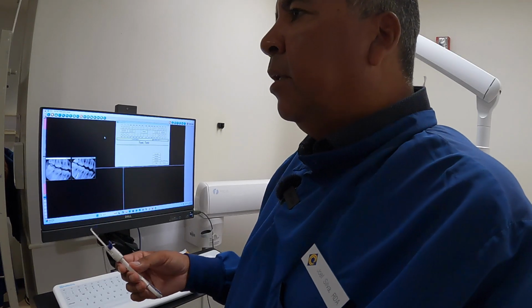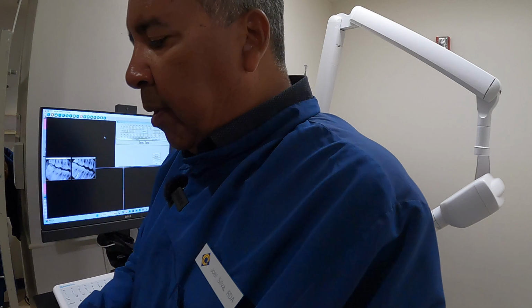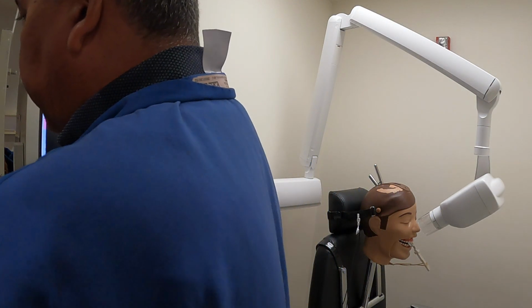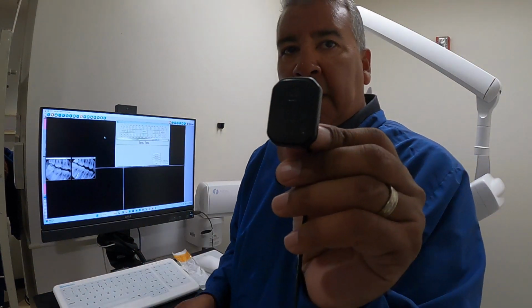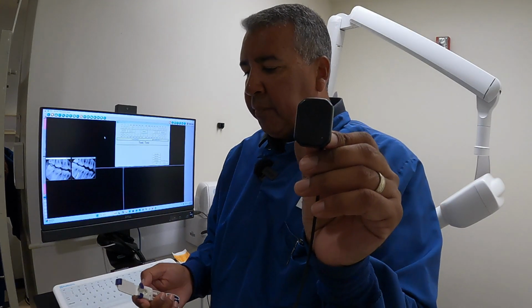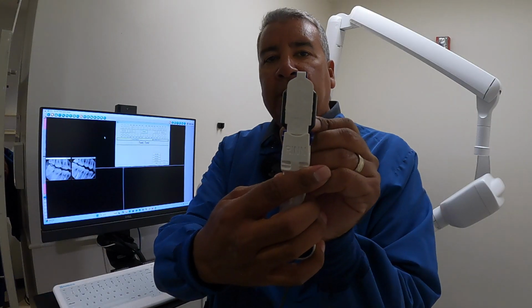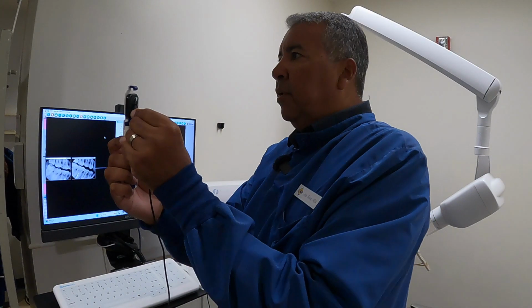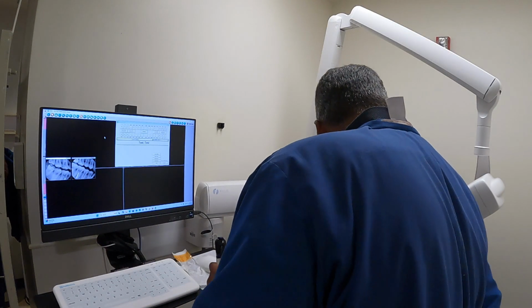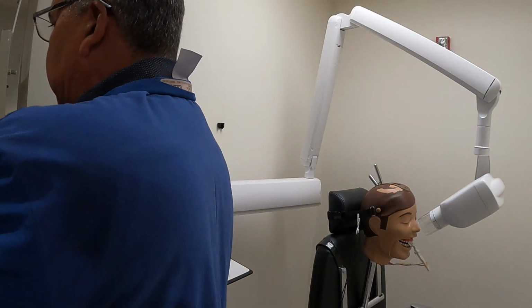I know this is going to seem a little odd, but when you place this on, remember that the part that says Dexis on it, the flat portion, is the side that goes to the PID. It faces the PID when you take the x-ray. But when we take the snap array, we place it up against the sensor so the white side is in front. It's not going to affect your sensor in any way, but I just want to let you know how that goes. So it's going to look like this, okay?